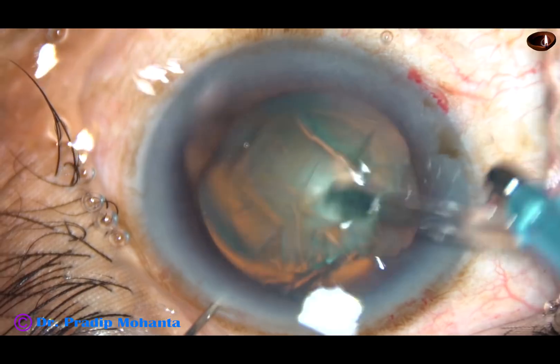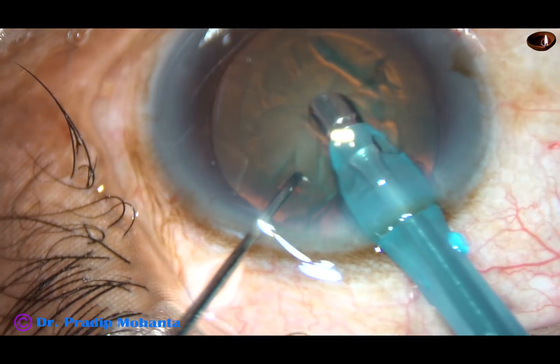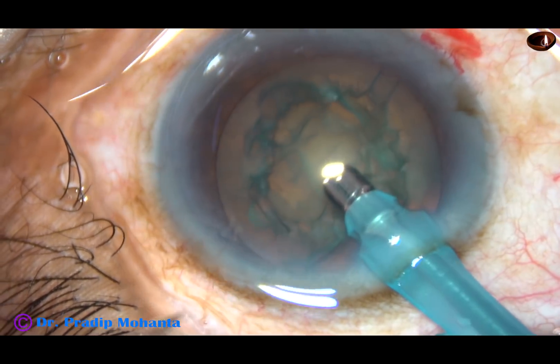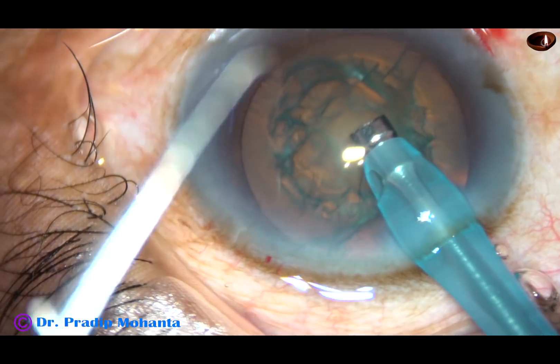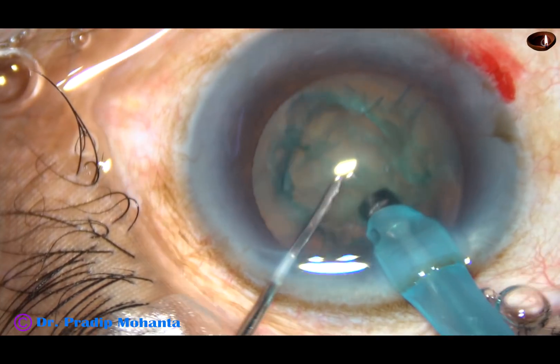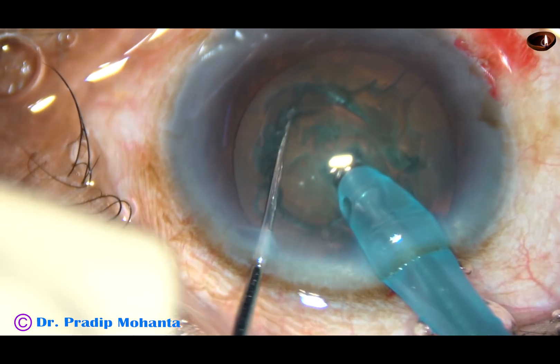Here goes the tip of the FACO handpiece, bevel down. Remove some cortical matter and this will improve visibility. Now turn the handpiece, make the bevel towards the corneal endothelium, bury the tip into the substance of the nucleus and chop the nucleus.